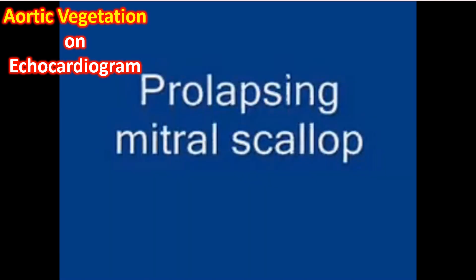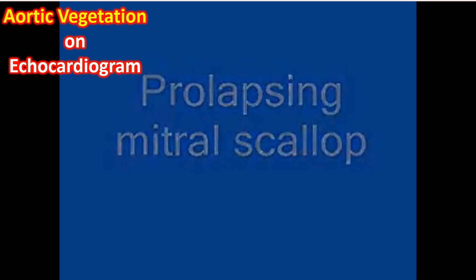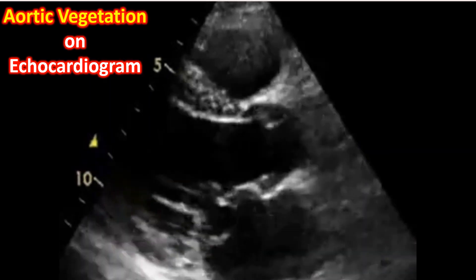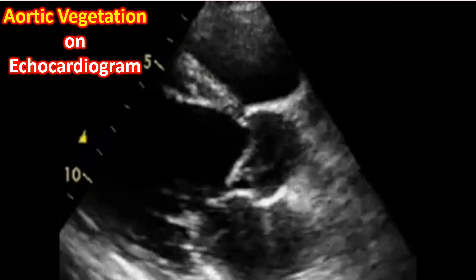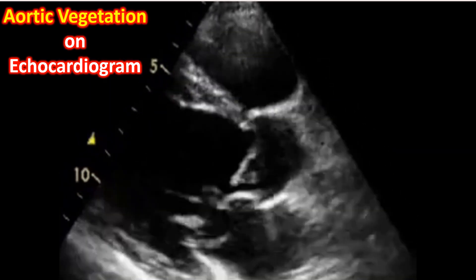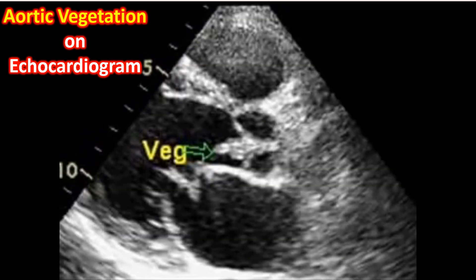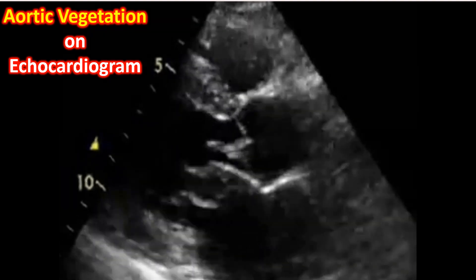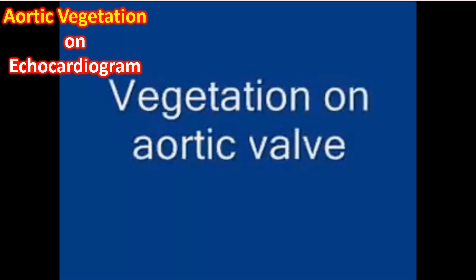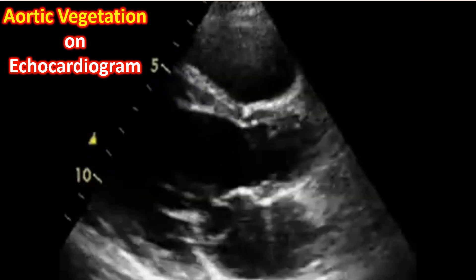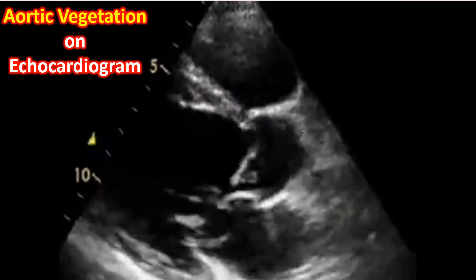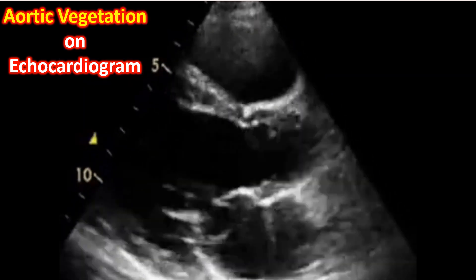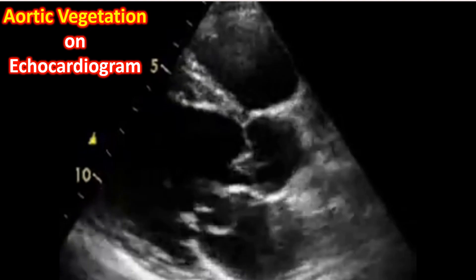In addition, there is prolapsing of a mitral scallop. You can see that in this view, in systole, a scallop of the mitral valve is prolapsing into the left atrium. This is the prolapsing mitral scallop. So there is vegetation on the aortic valve and a prolapsing mitral cusp in systole.